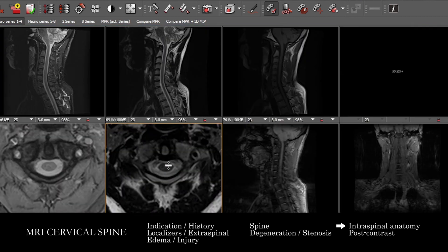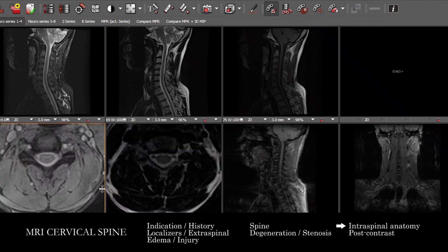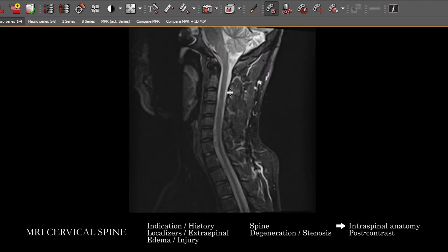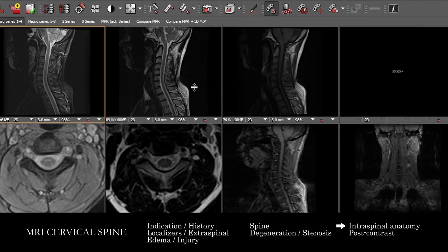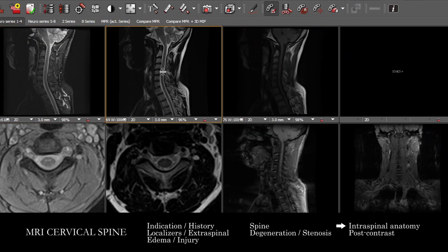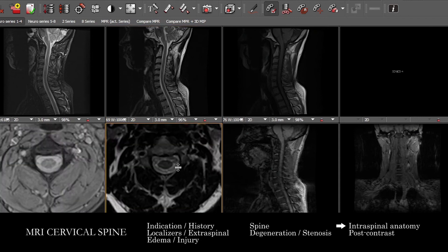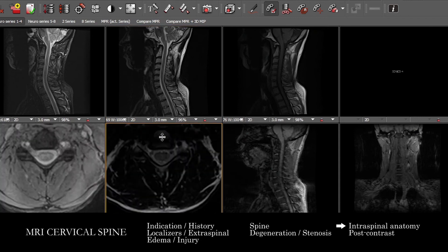Cord signal assessment is frequently best done on axial images. It's very difficult to trust whether any signal you're seeing on the sagittal images is real — particularly on the STIR, which is going to be very noisy, and on the T2, where you'll often get motion or pulsation artifact that can make it difficult to determine if any signal is genuine. So it's really important to correlate between the different sequences.